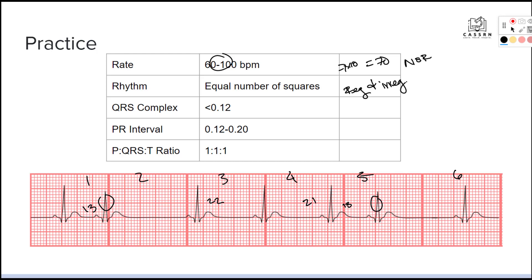Then we look at our QRS complex and see if it's below 0.12. Counting the small squares, we get 3 for each QRS complex. Each small square is 0.04, multiplied by 3 gives us 0.12 — that's normal. Then for the PR interval, we want it to fall between 0.12 and 0.20. Finding the P wave and counting gives us 3 small squares, which is 0.12 — so that's normal as well.